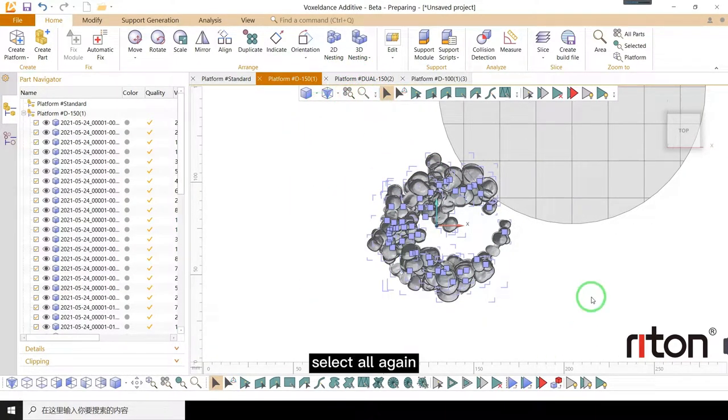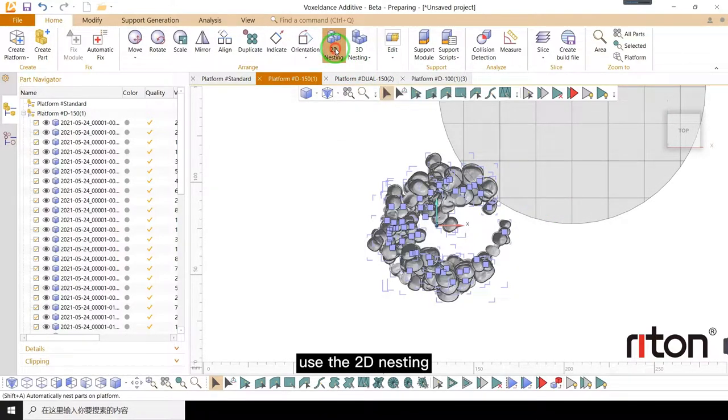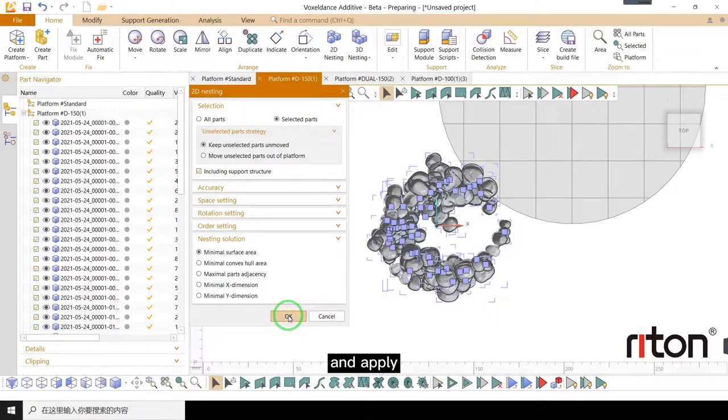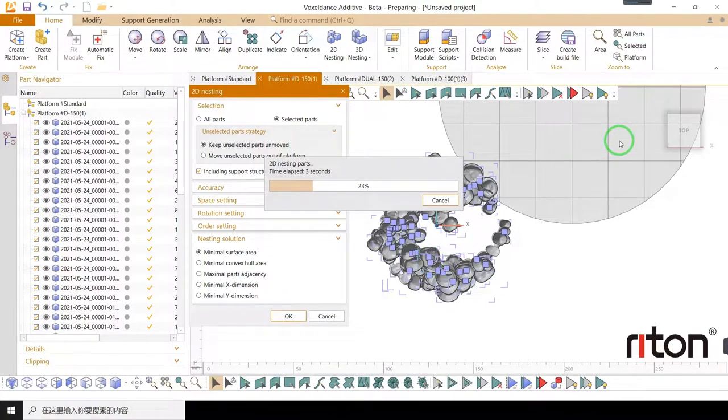Select all again. Use the 2D nesting and apply. All the parts will be arranged on the platform automatically.